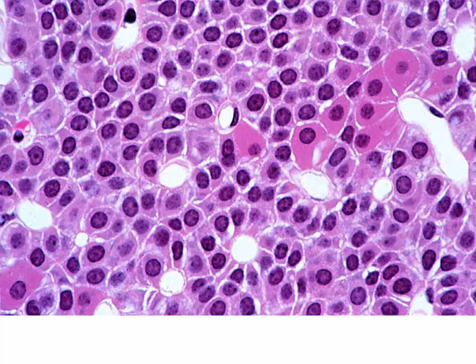So here we're looking at the parenchyma in our parathyroid. And as we look at the parenchyma, remember, we are going to have two cell types. The majority of cells that we see in this field, these are going to be our chief cells, but then we're also going to have our oxyphil cells. And those are going to be present. These are the much larger ones that we see here. These are our oxyphils, and the remainder are going to be our chief cells.